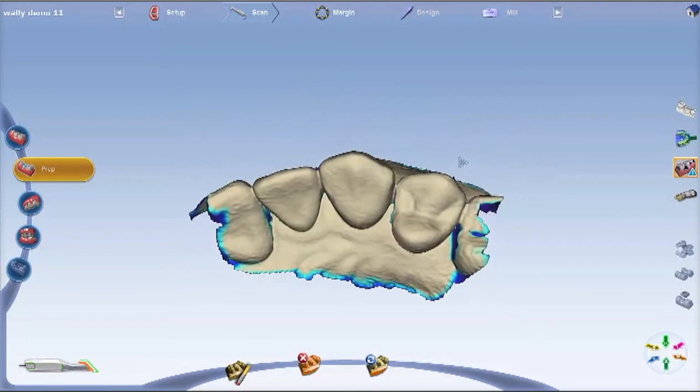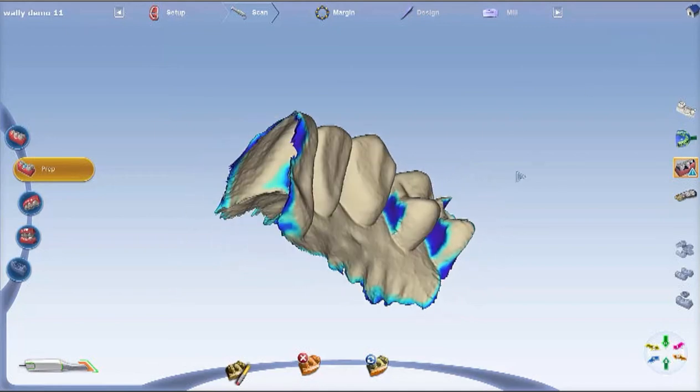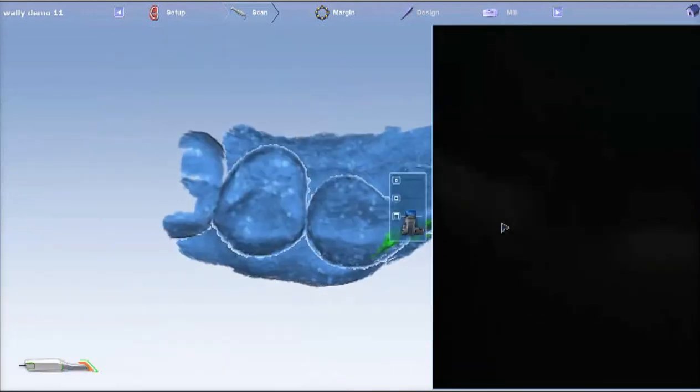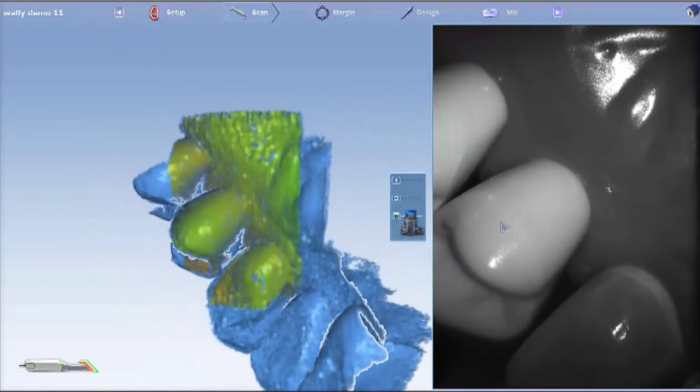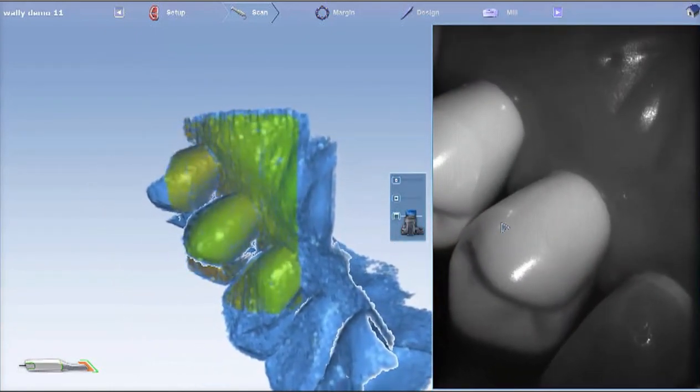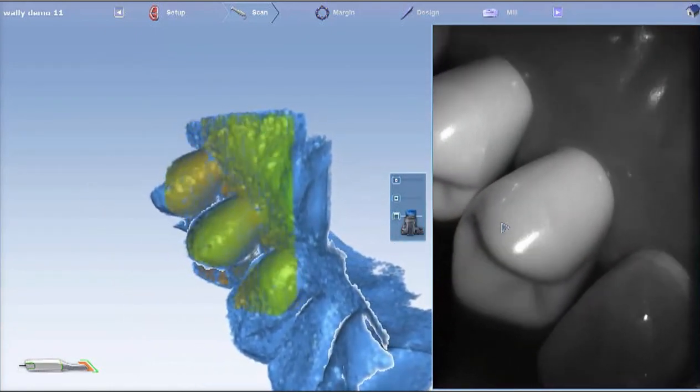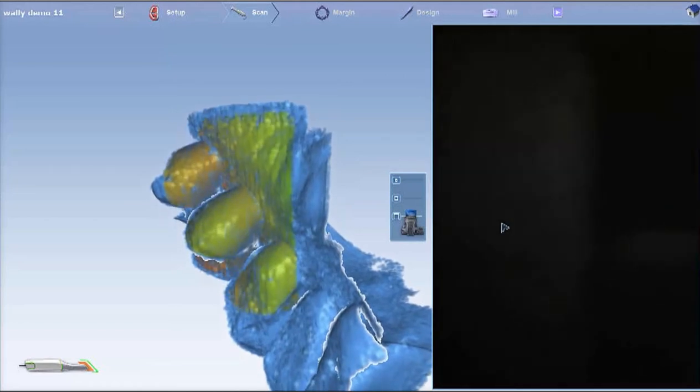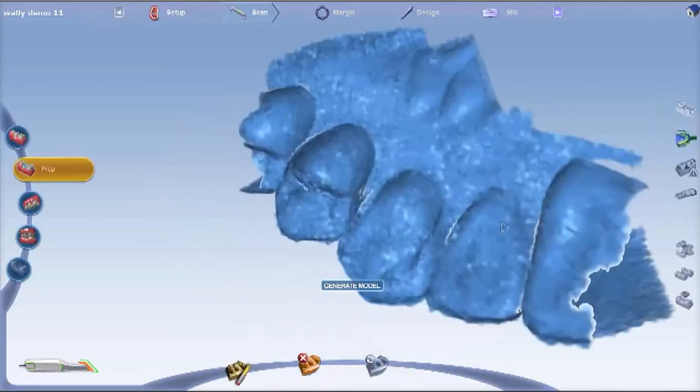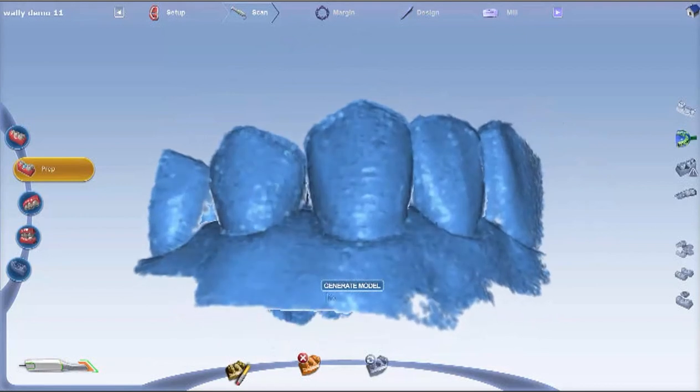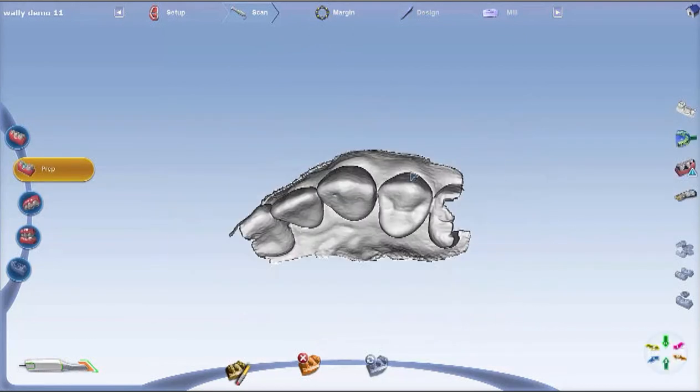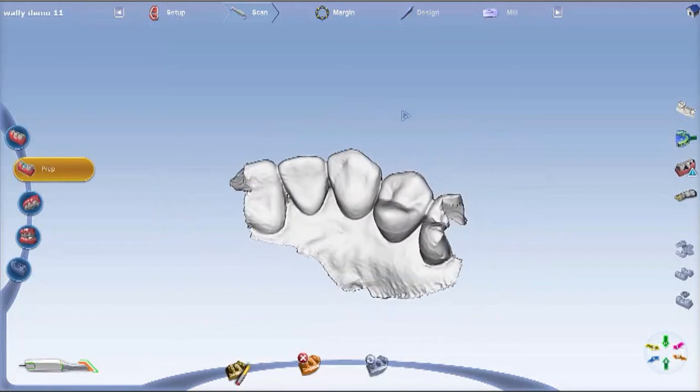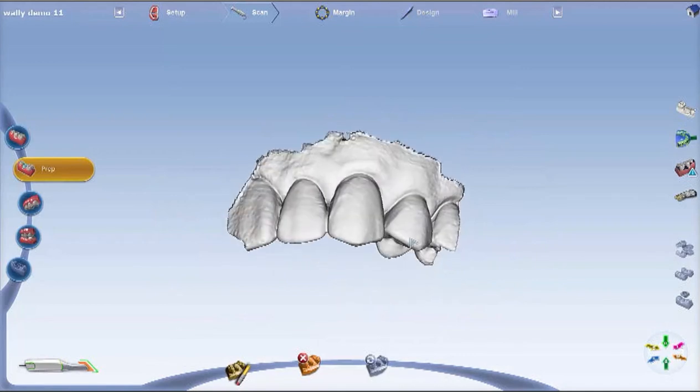But your master or your wax-up, whatever you're doing your grading on, should be pretty nice. If you missed an area that you thought was essential to the model, you can click the power button on and go immediately to that spot, making sure you have enough data to allow it to stitch back in. If it was a significant area, you would want to start on a tooth you already scanned perfectly, then go to the defect.